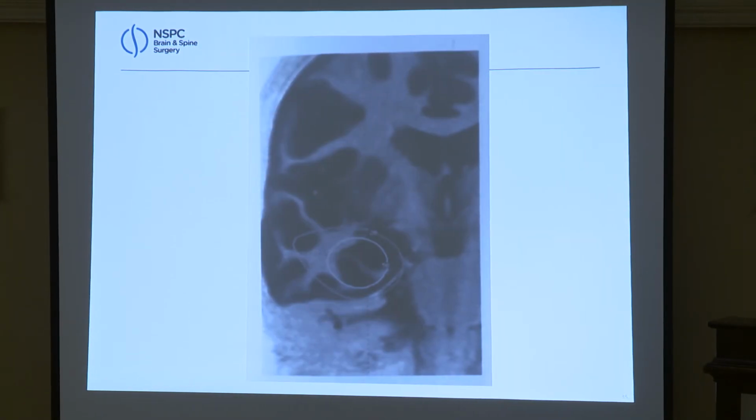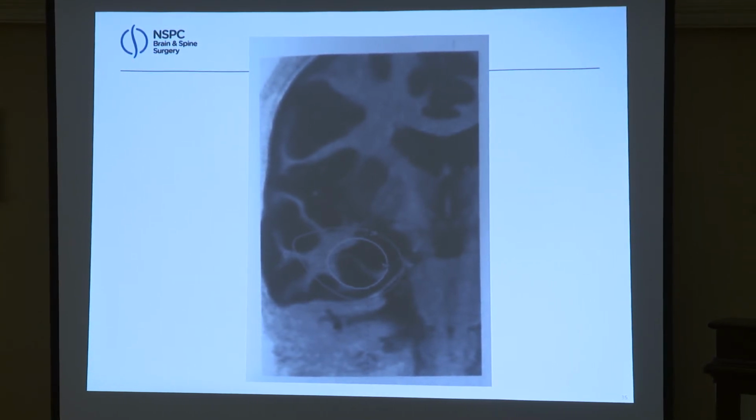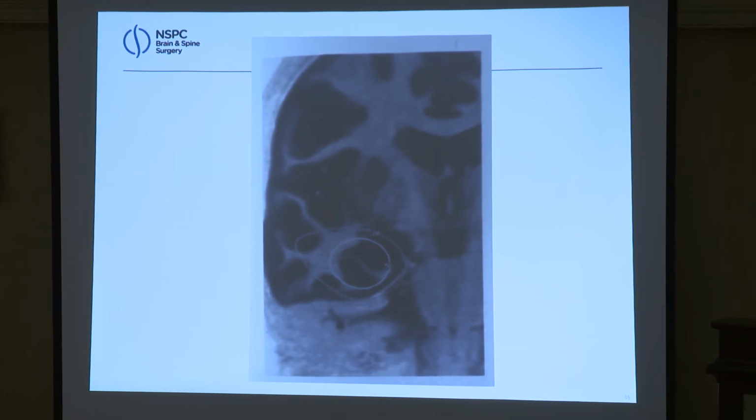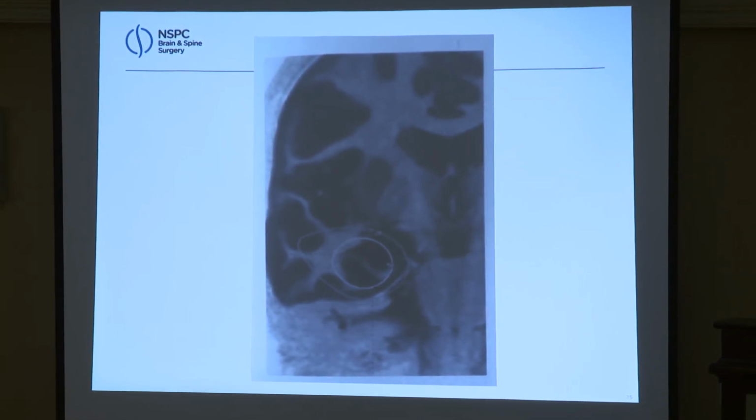Again, I would say we don't do too much of this, and often people are going for deep brain stimulation for this. This is an example of Gamma Knife for epilepsy, for medial temporal lobe epilepsy. Again, there were studies done on this, and I think this has not really taken off so much, and the problem is it's a big area. You often have to get a lot of necrosis, and people are now looking at other treatments like the LITT treatment, where they do some other minimally invasive needle-based injury to the temporal lobe, or just do a standard temporal lobectomy. But this was thought of as an idea, but again, we're not really doing too much radiosurgery-based movement disorder and not much epilepsy at all.